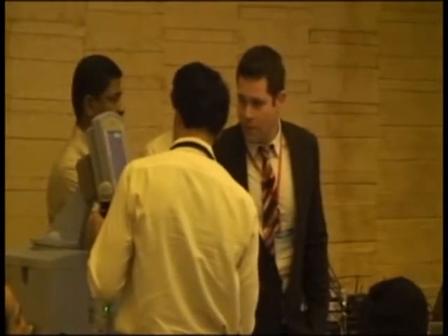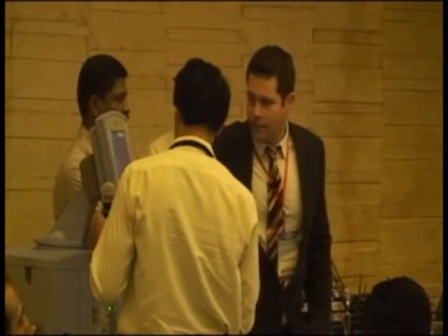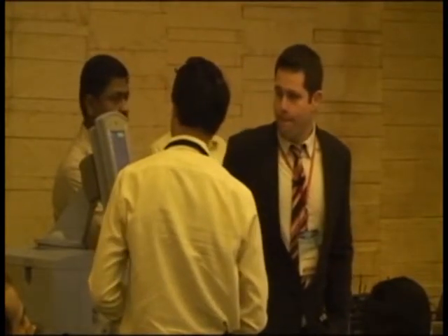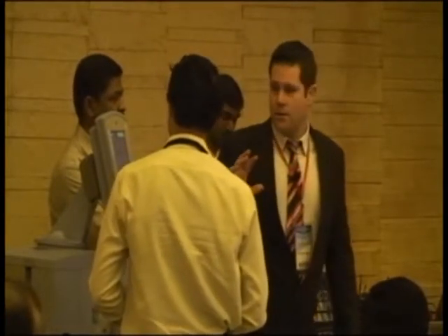So you want to reduce the inspiratory time? So we'll go up on the flow rate. There you go. Very good. Let's turn our flow rate up. Yeah, he's still not exhaling back to zero flow. But this is the rate that we need to maintain ventilation in this child. Is there anything else we can do?